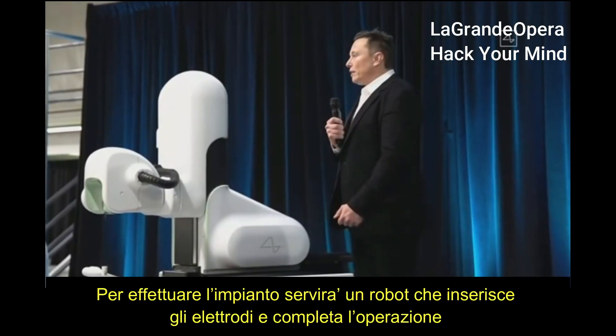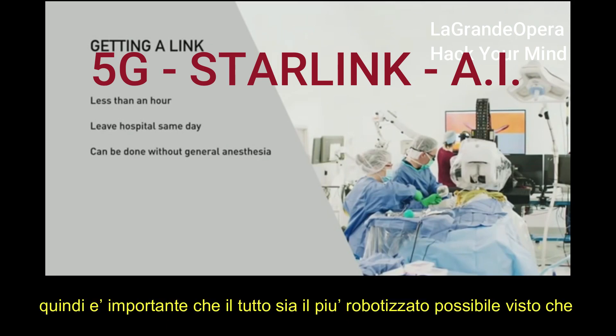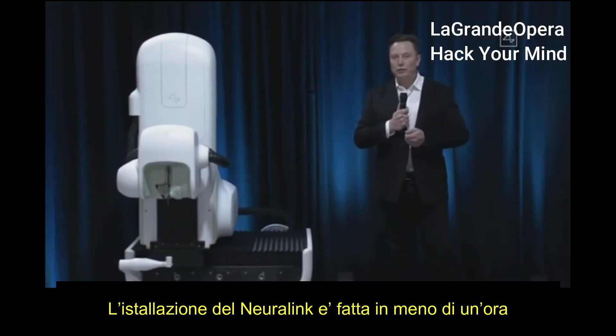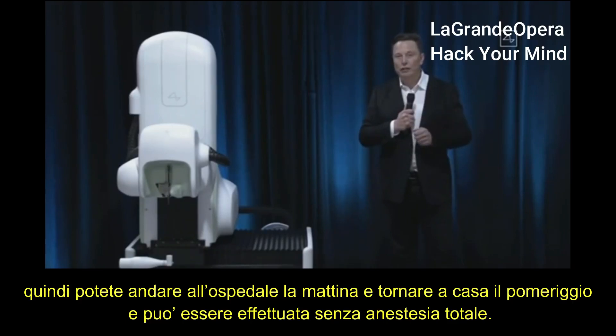To get a link, you need a great device and a great robot that puts in the electrodes and does the surgery. You want the surgery to be as automated as possible, and the only way to achieve the level of precision needed is with an advanced robot. The link installation procedure is done in under an hour — you can basically go in in the morning and leave the hospital in the afternoon. It can be done without general anesthesia.